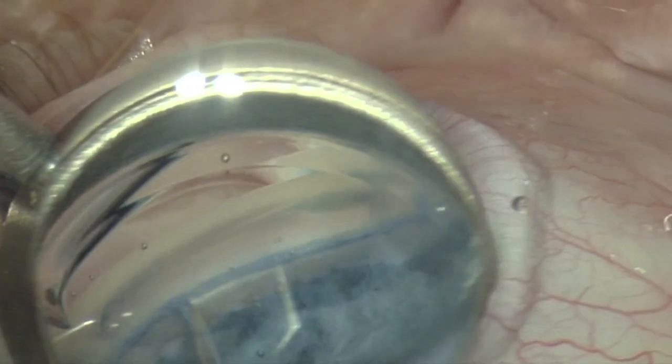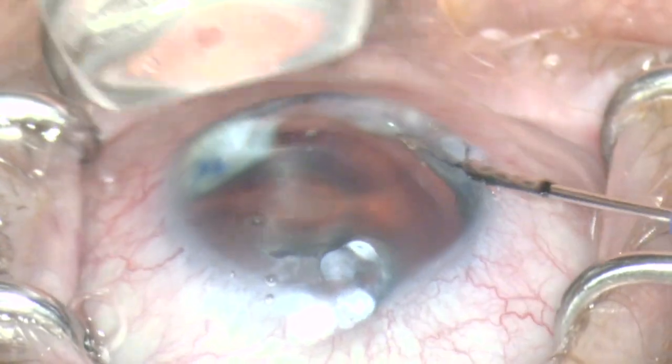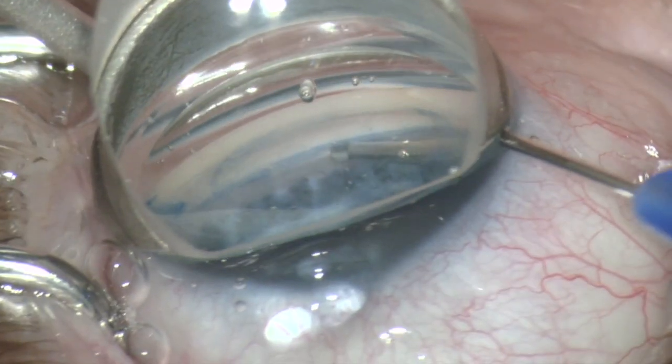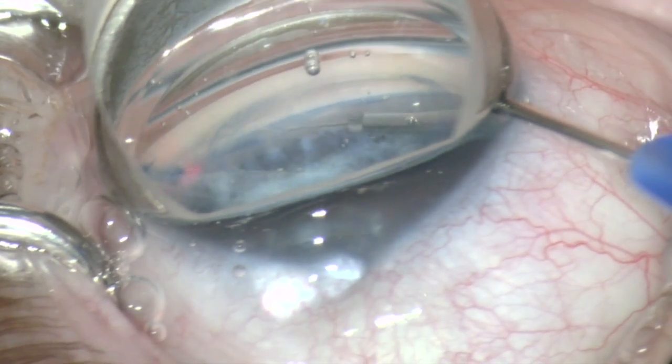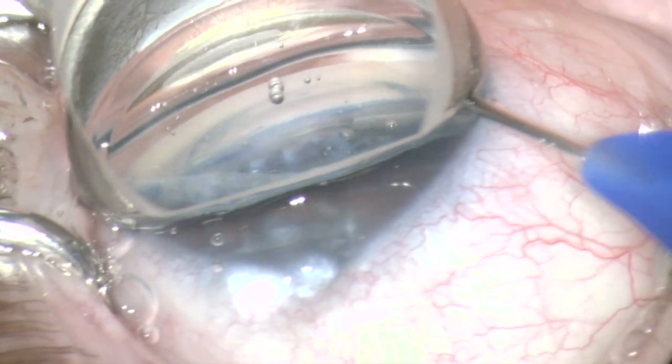A Sinskey hook can be used to make a small goniotomy in the nasal angle to make it easier for the trainee to dock the cannula tip and insert the catheter into Schlemm's canal. The blinking red light at the tip of the catheter can be seen.